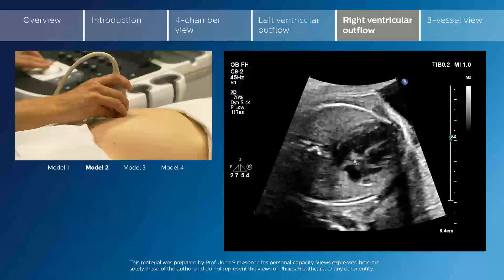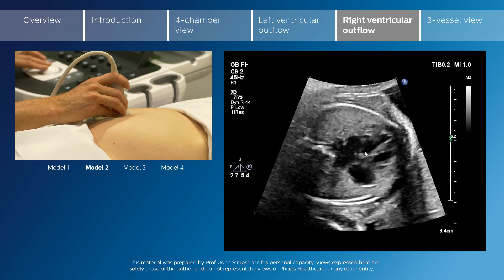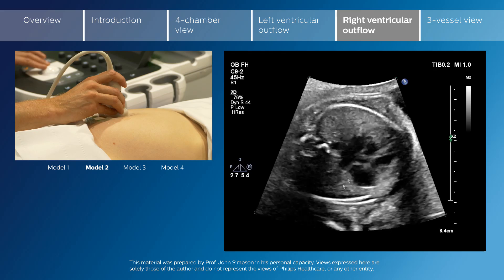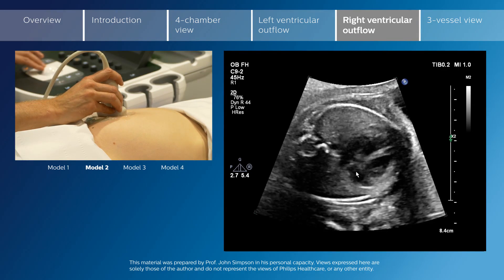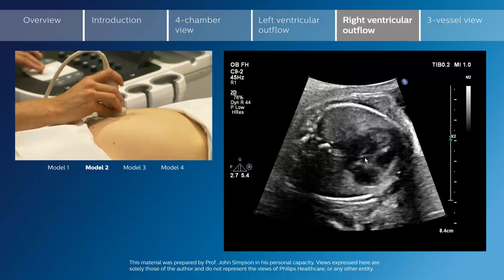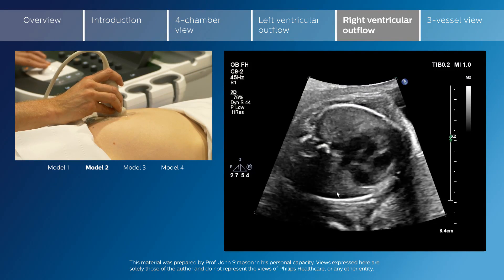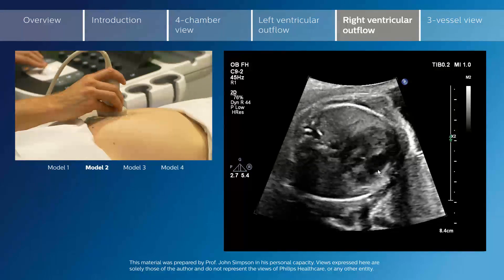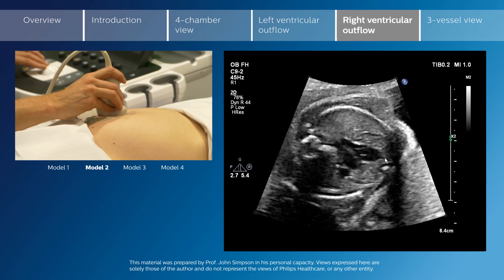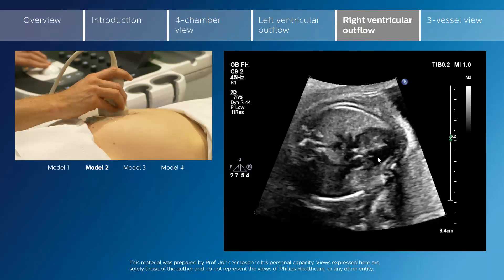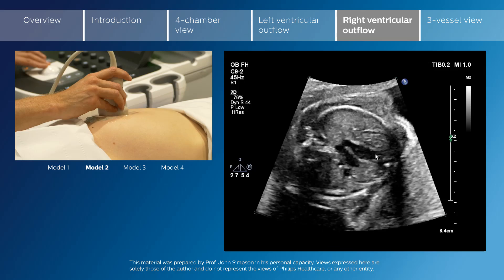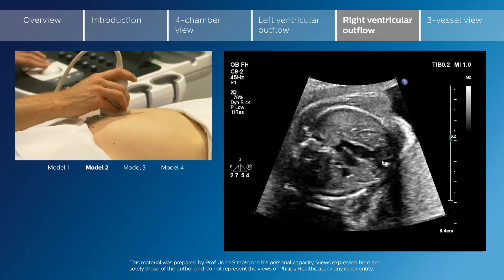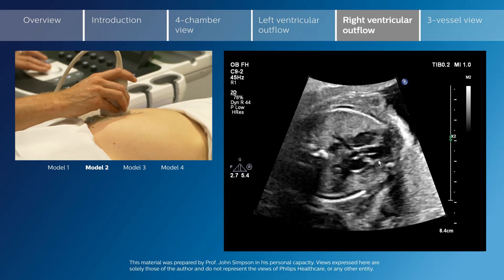As the ultrasound transducer is angulated more cranially, the first vessel which is encountered is the aorta, which leaves in the centre of the heart and heads towards the fetal right shoulder. The aortic valve can be seen to open and close here. On sweeping cranially again, the pulmonary artery is now seen, which takes a course directly anterior from the anterior chest wall through towards the spine, taking a more or less directly anterior-posterior course.